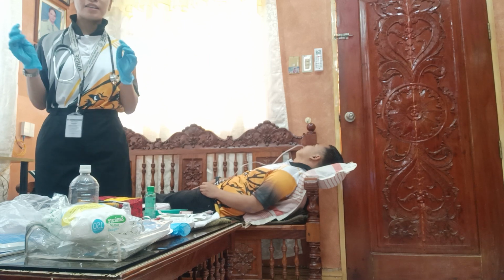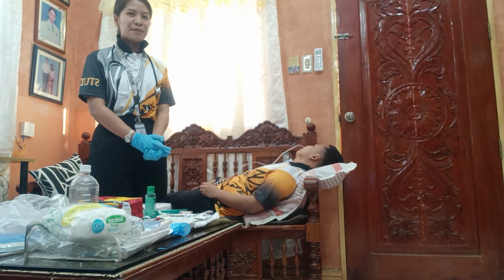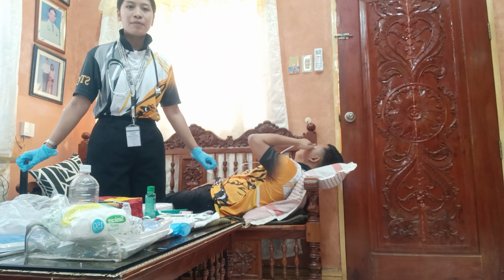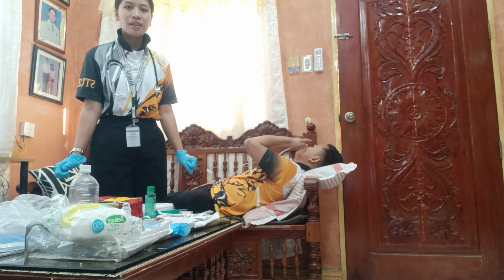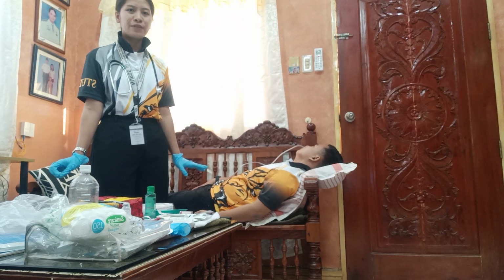The pH of the intestinal fluid is 7.0 or higher. The pH of the respiratory fluid is 6.0 or higher. The method will not effectively differentiate between intestinal fluid and pleural fluid.